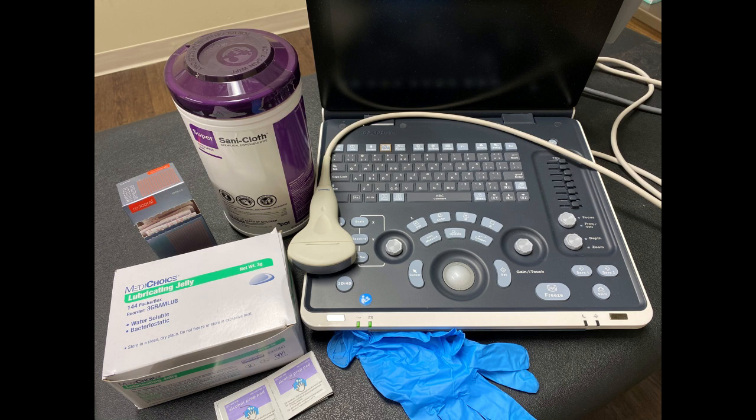You definitely need gloves and alcohol — do a thorough alcohol wipe down before any ultrasound-guided dry needling technique. Then obviously you need a needle. I like to use the Myotech needles. You need a pretty long needle for psoas — probably 75 to 100 millimeters to get through all those layers — depending on the size of the patient. And you need ultrasound gel. If you're needling through ultrasound gel, you cannot use that old bottle of blue ultrasound goo you've been refilling for years — that thing is full of bacteria. You need sterile ultrasound gel: either medical-grade sterile gel or, on the cheaper route, individual packets of sterile lubricating jelly, which works just as well and is a fraction of the cost.